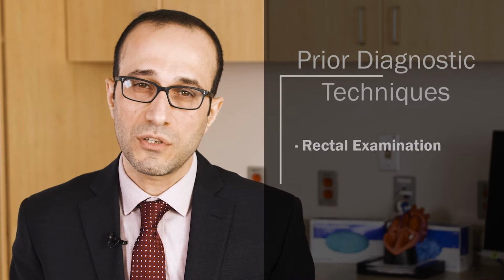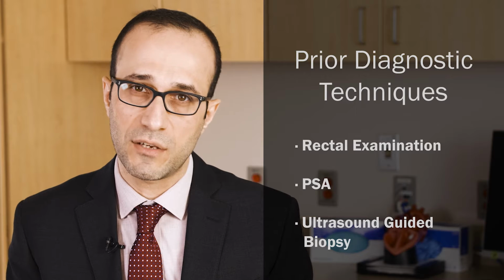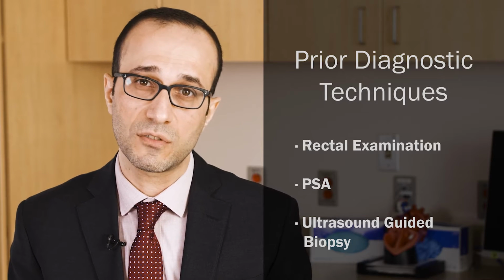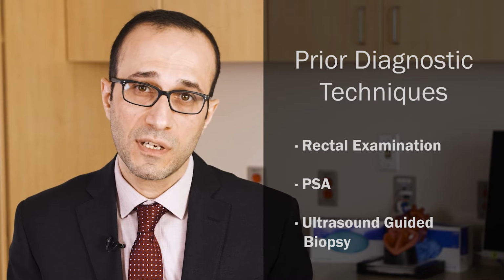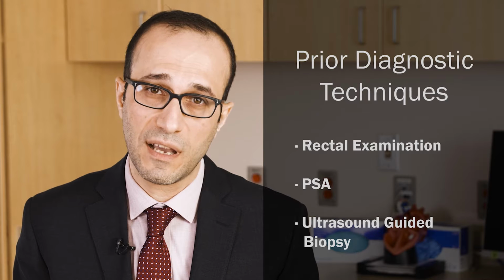Prior to discussing the multiparametric MRI, I would like to briefly review how we used to diagnose or screen patients for prostate cancer in the past before the introduction of this new imaging modality. The diagnosis used to rely on digital rectal examination that will be done by your primary care physician or by your urologist, in addition to a blood test that is called the PSA. If any one of these two tests is worrisome, then your provider may ask you to further explore the possibility of having cancer by doing an ultrasound-guided biopsy.